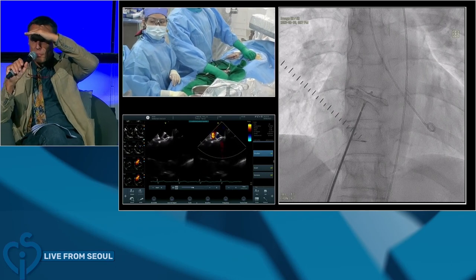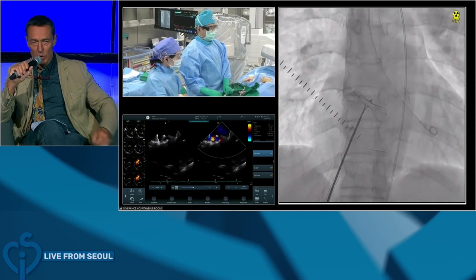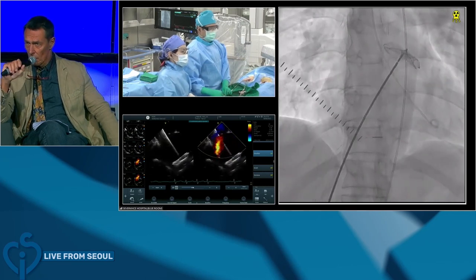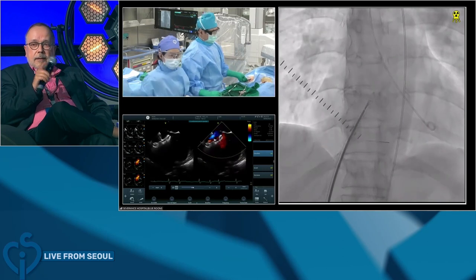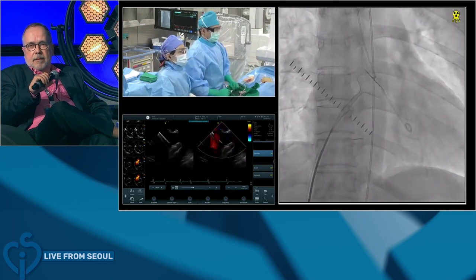Just two. Peter, I think that the bigger device may be safer. Yes, I think you need more stability around the aorta. Especially pushing. The other Peter, I would use 28. 28 may be an option, but we have to move to 26 first.